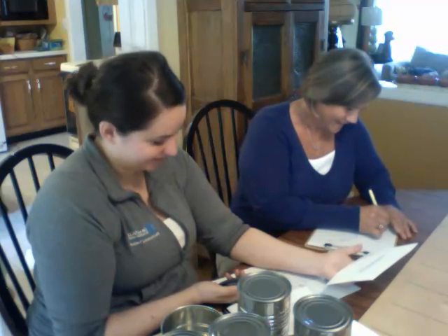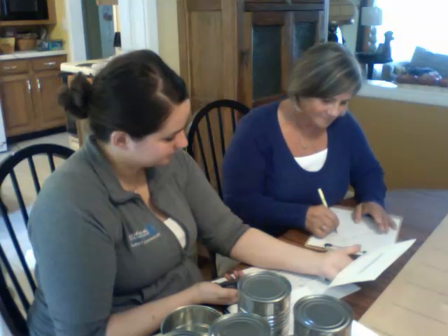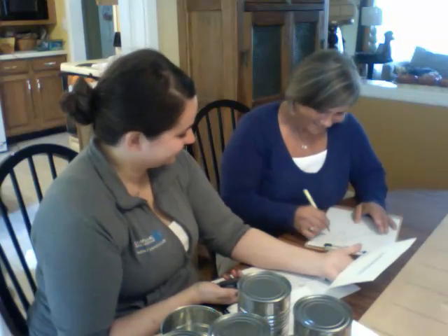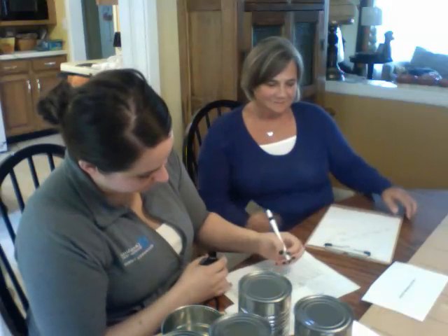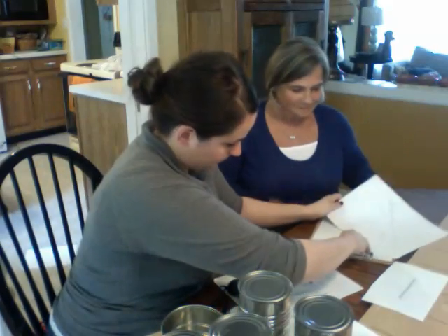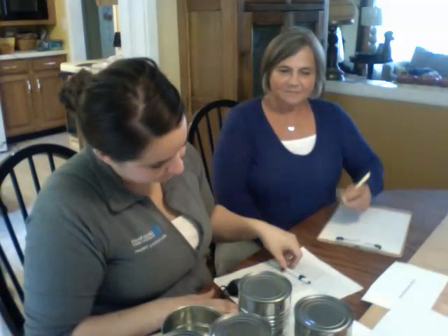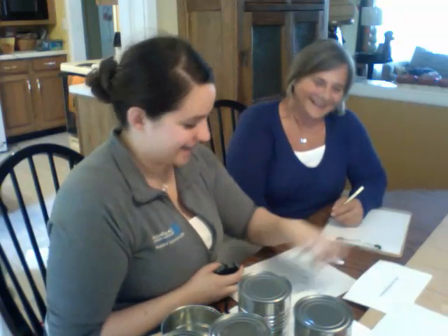You're really struggling in this. You're doing a really good job. Okay. All right, good job. All right, now we're going to go ahead and do the same thing with your right hand. So we'll get a new sheet of paper for you. And that's good, it's just as quickly and clearly as you can. And you did a good job. You're a little competitive, I understand. But maybe when we reassess this later, your time will go down. So this is a good starting point for us.